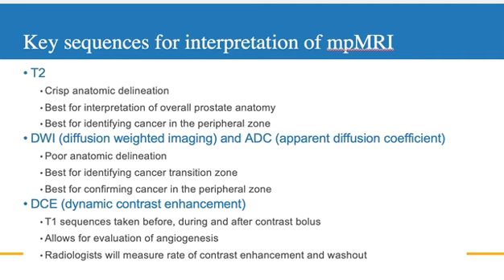The final sequence is known as dynamic contrast enhancement. And this is actually a T1 sequence that is taken before, during, and after contrast administration.